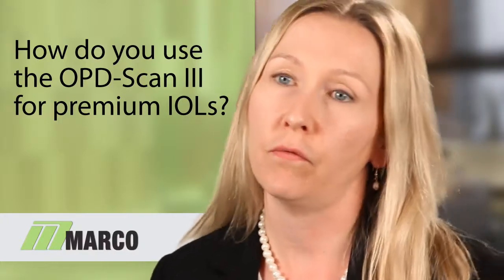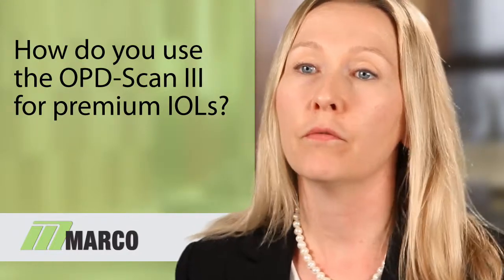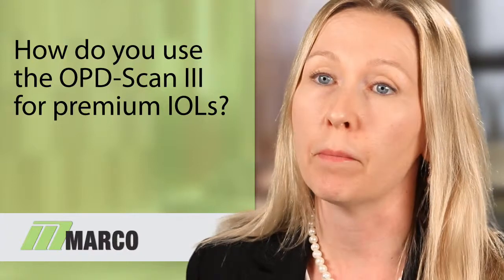Another nice piece of information is also that OPD is a corneal aberrometer, as well as an aberrometer of the entire eye. And so you can look and see if the patient's corneas are irregular, and to what extent they're irregular, whether or not these patients become good candidates for premium IOL implantation. So all these pieces of information can help us show patients how they're going to do with the premium IOL and if they are good candidates.